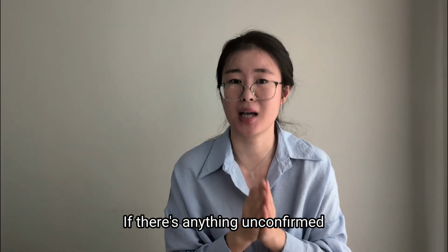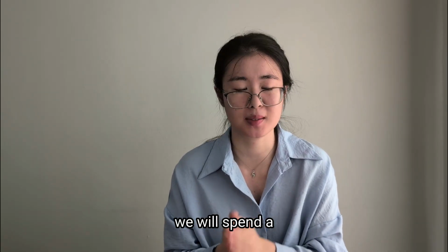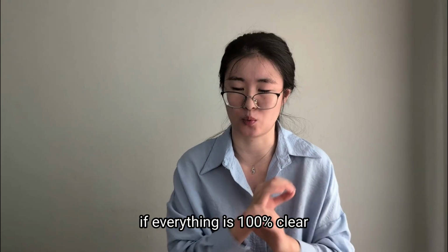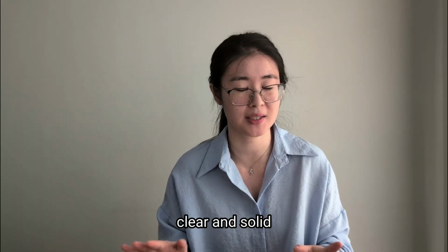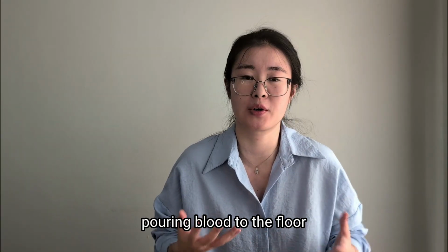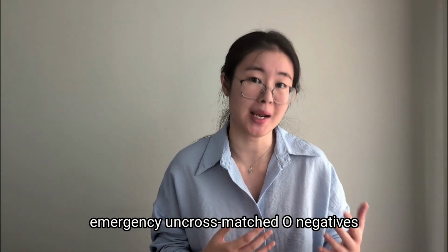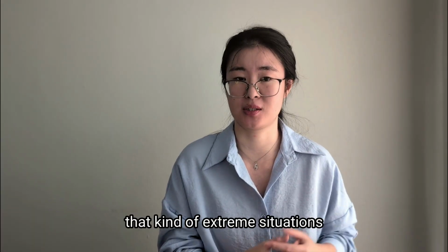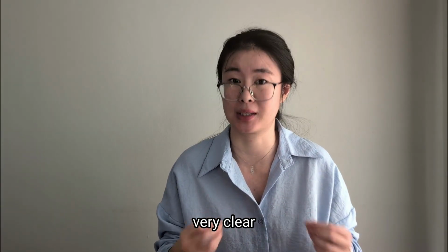If there's anything unconfirmed on the patient chart, on the patient history, we will spend a lot of extra time trying to figure out if everything is 100% clear. And before everything is clear and solid, you are not getting your blood. Of course, if your patient is pouring blood to the floor, you may get some emergency uncross-matched O negatives. But for the patients who are not in that kind of extreme situation, we would spend a lot of time just to get things very clear.